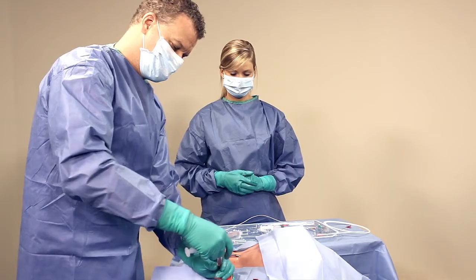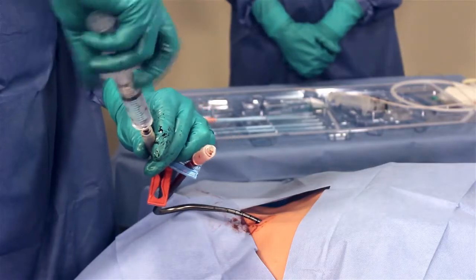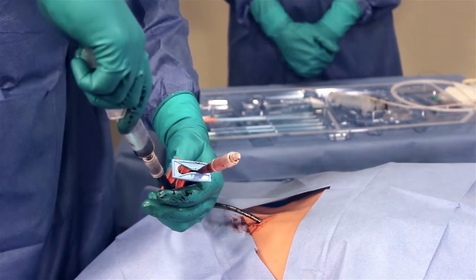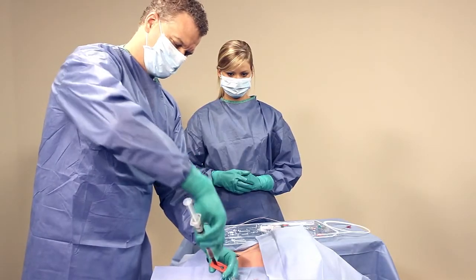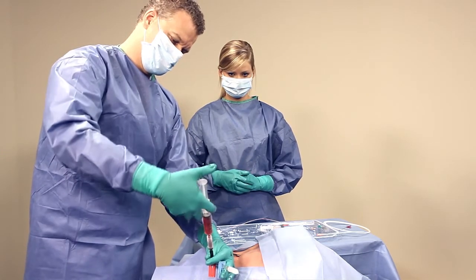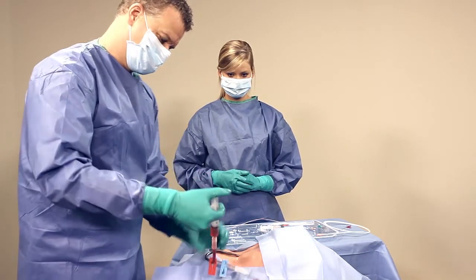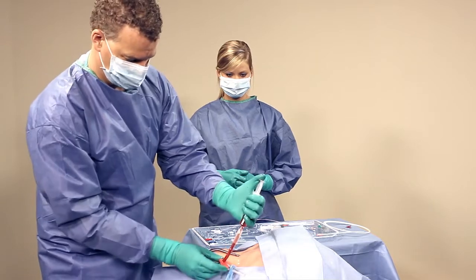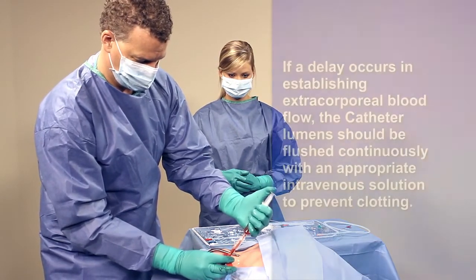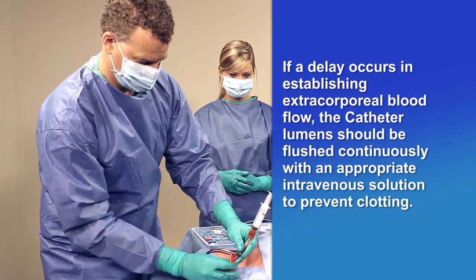Attach a 20-milliliter syringe filled with 15 milliliters of sterile saline to the priming adapter of each catheter lumen. Release each clamp and aspirate blood through both lumens. Next, irrigate both lumens with saline-filled 20-milliliter syringes using a quick bolus technique. After flushing, clamp both lumens until you are ready to connect the blood tubing.